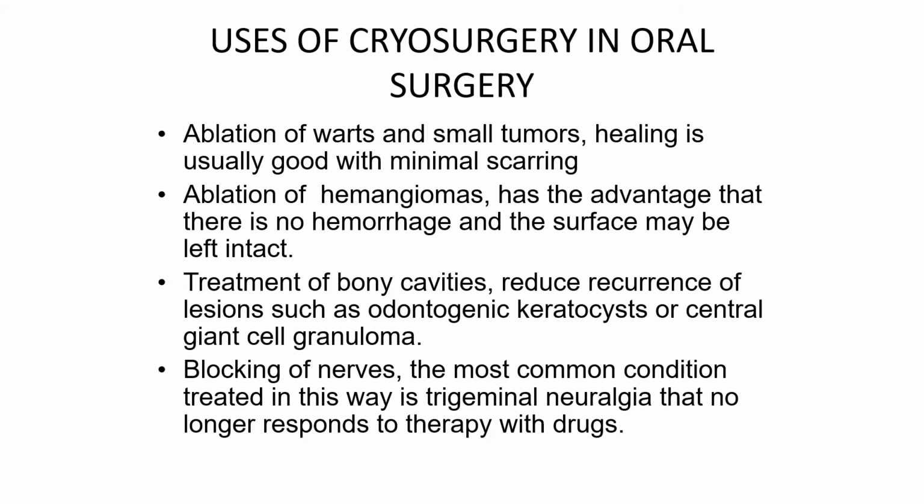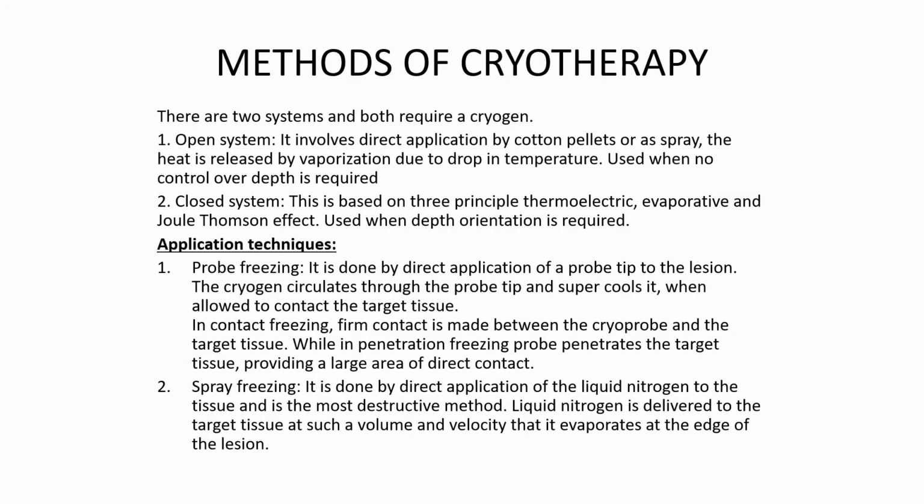وآخر شي blocking of nerves. The most common condition treated in this way is trigeminal neuralgia that no longer responds to therapy with drugs. Methods of cryotherapy. عندنا two systems واثنيناتهم يحتاجون للكرايوجين.